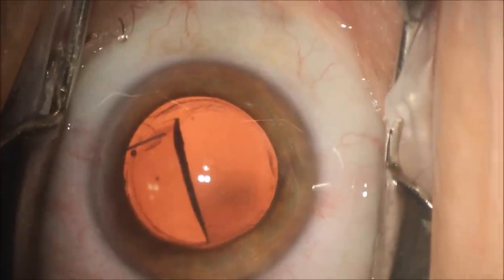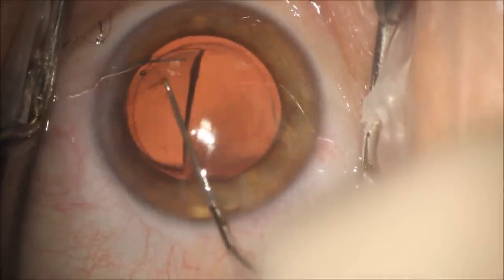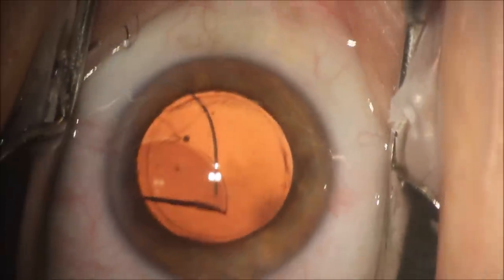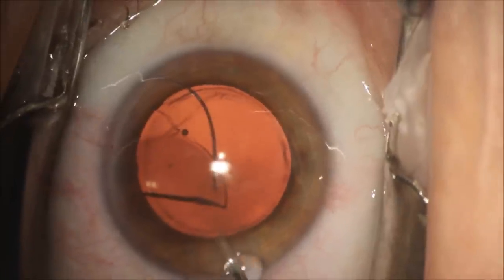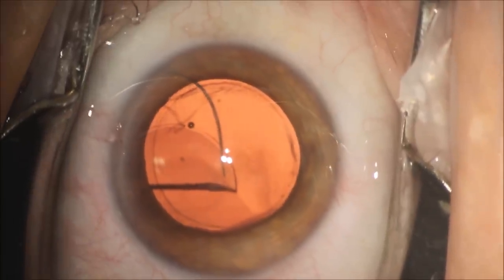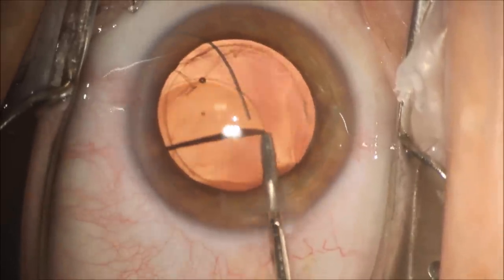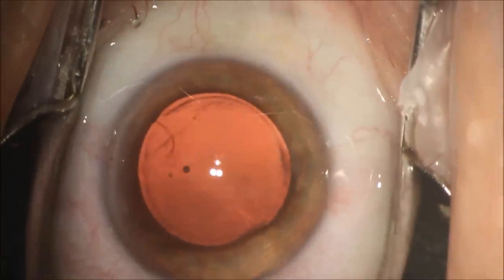We now use the Sinsky hook to rotate the last half so that the haptic-optic junction is facing in the correct position to be easily removed from the eye. Again, we use the microforceps to grab part of the cut optic and then bring it through the clear cornea incision after we instill viscoelastic both above and below the lens fragment. You can see we remove it here with the intraocular forceps by grabbing that optic.